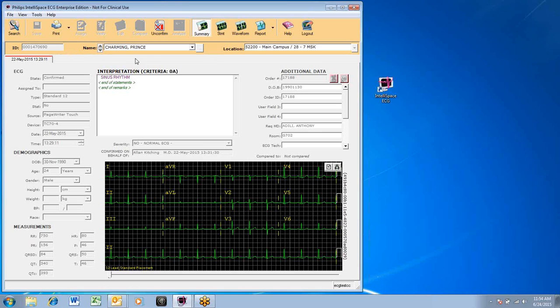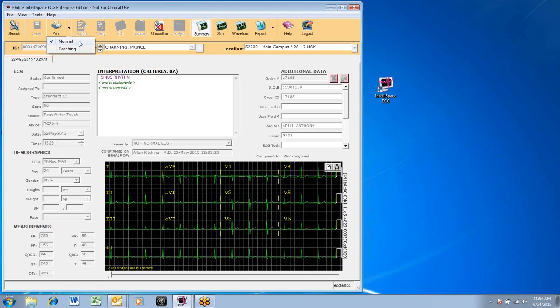The print button will print the ECG. Normal prints the ECG with the patient demographics, while teaching prints the ECG without the demographics for confidentiality and teaching purposes.